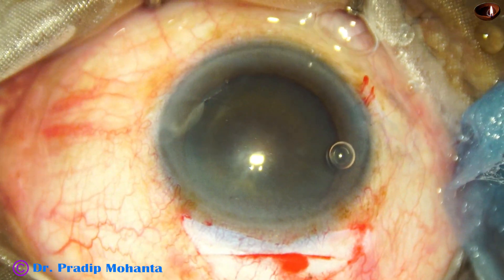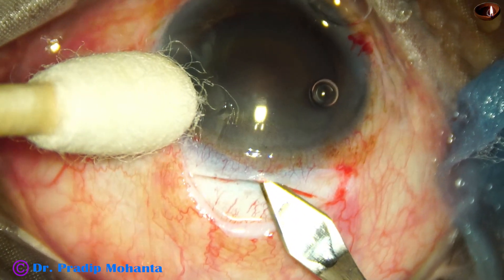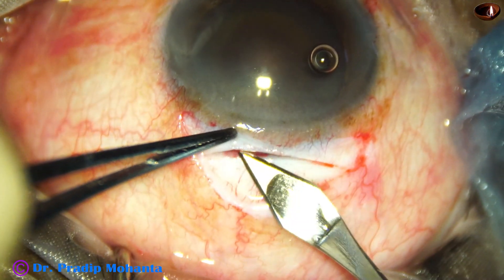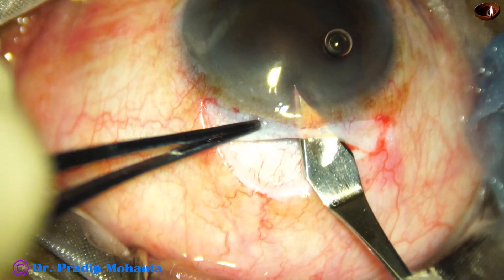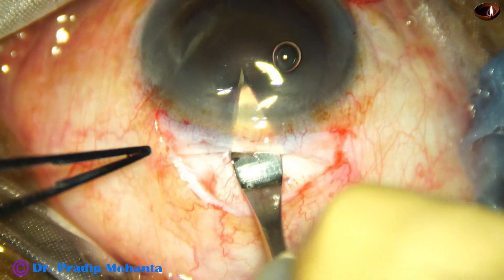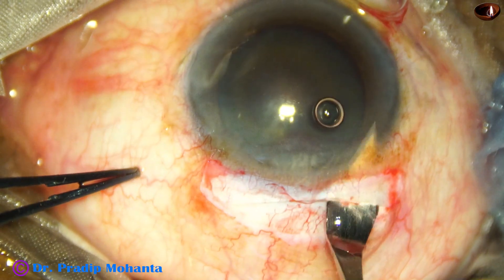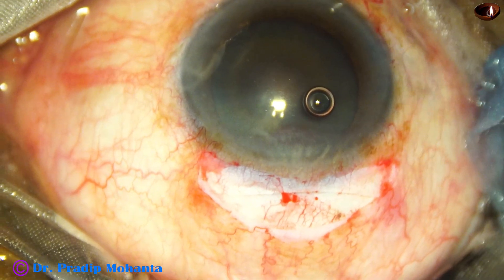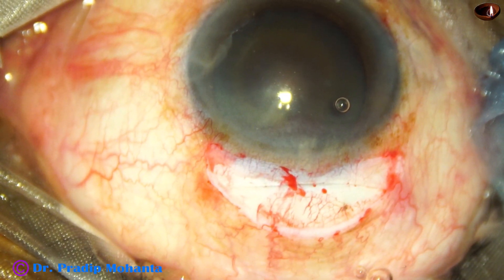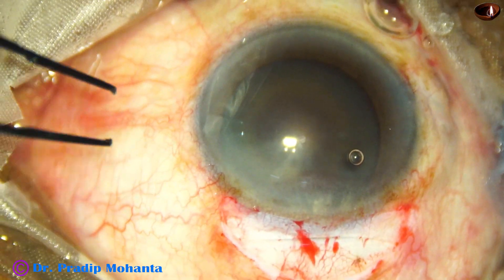Now the sclerocorneal tunnel will be opened. The keratome is taken; it goes to the anterior extreme of the tunnel — that means it goes into the cornea until the tunnel is fully made. Then it goes downward and we cut with forward movements only. Engage the keratome at one side and just by forward movement you cut it. If you cut in both directions — going forward and coming backward — there is a greater chance of leakage of fluid through the main wound than when you make a single plane.